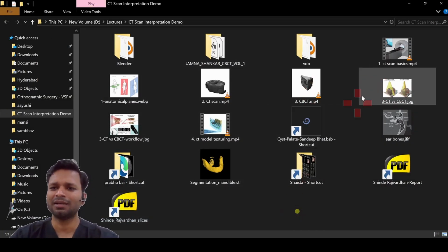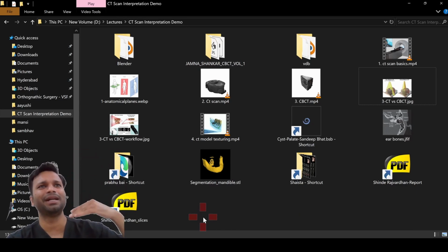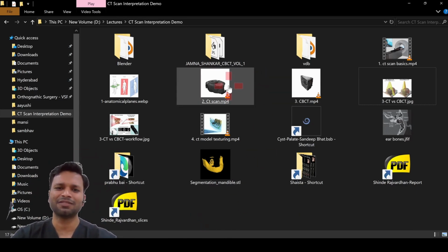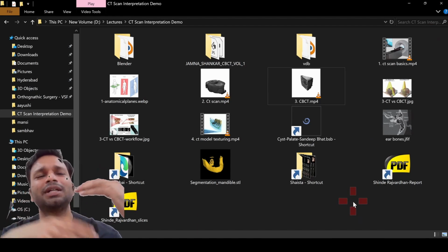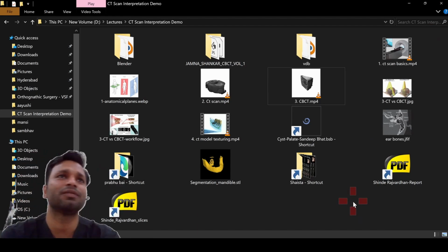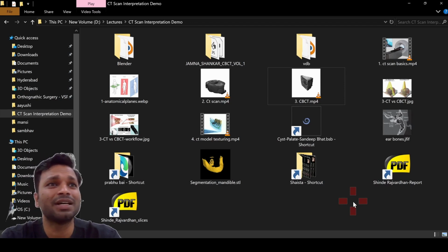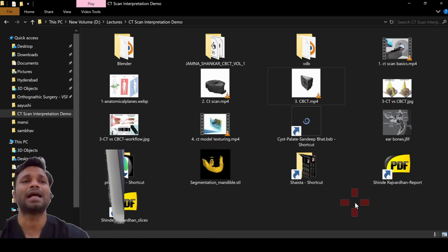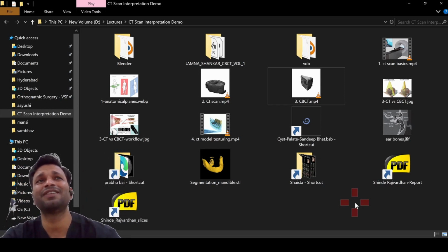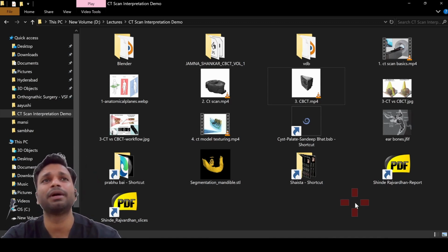So अभी जो CT scan मैंने दिखाया था ना, in that we had around 350 slices. So the patient was irradiated these many times for every slice, right? Whereas in this 5 or 6 volumes ही record करने होते हैं. So the exposure to the patient is almost 30 times less in CBCT as compared to conventional CT. One thing, in conventional CT, the quality of image recorded nowadays is way higher as compared to cone beam CT. Okay, and of course the time required to record in cone beam CT is very less, whereas in CT scan it is way longer as compared to cone beam CT.